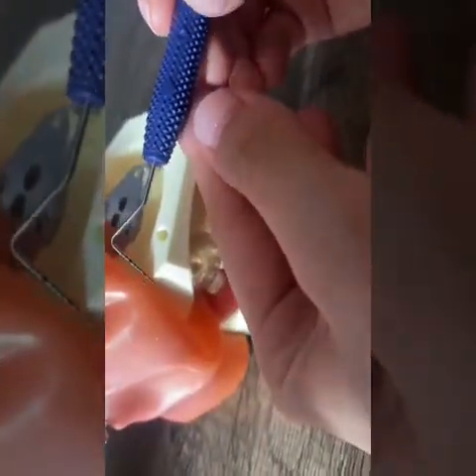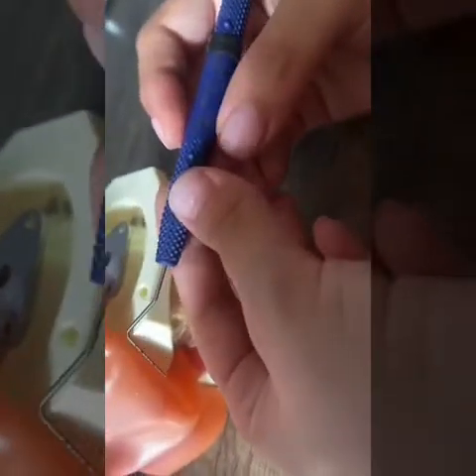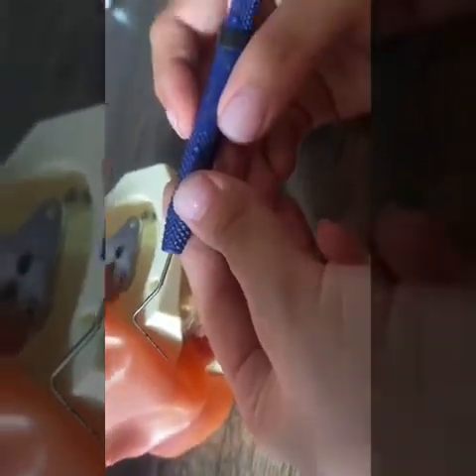This instrument is used to measure periodontal pockets, but it can also be used to measure clinical attachment loss, measure lesions, assess bleeding, and measure recession.